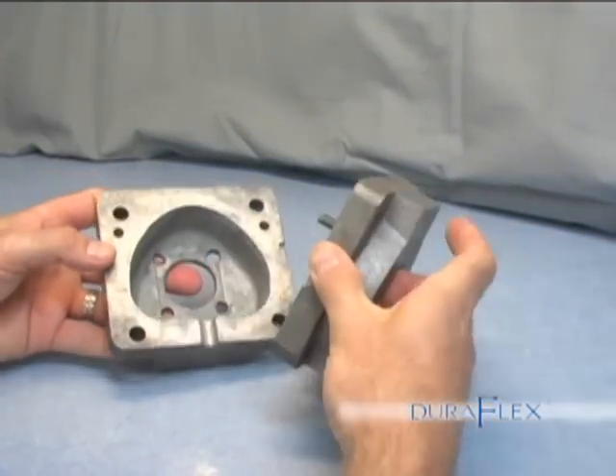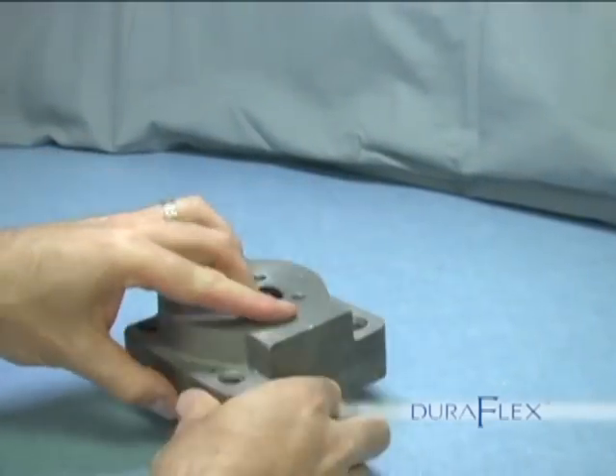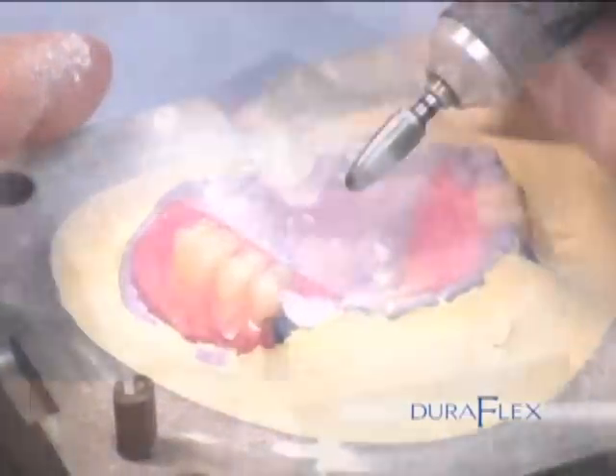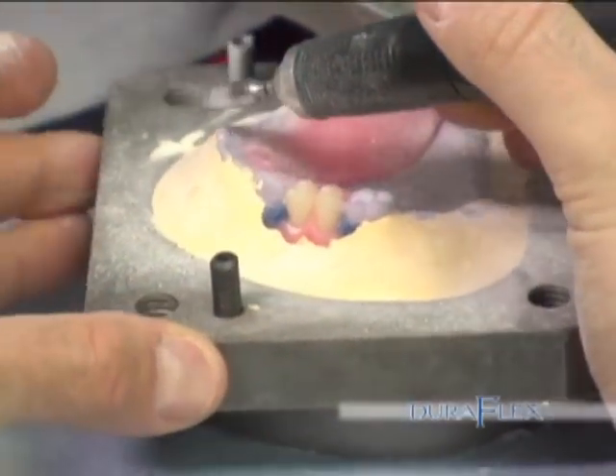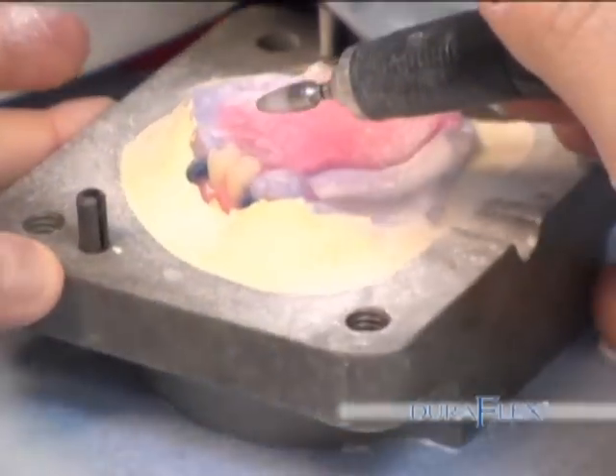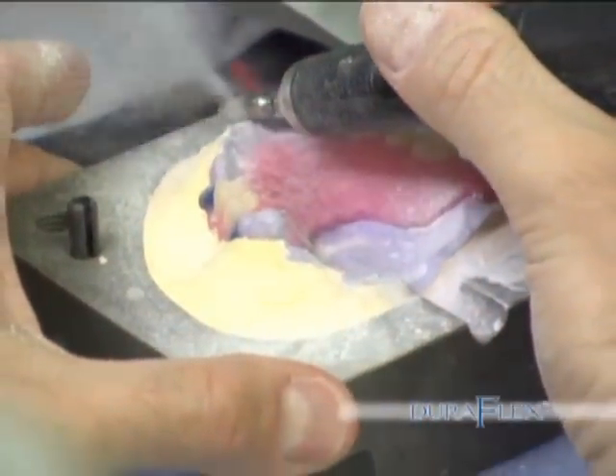Next, invest the wax case in the lower half of the flask using yellow stone. Make sure that no teeth could break off during the separation of the two flasks. Grind off anything that would keep the two flasks from separating.